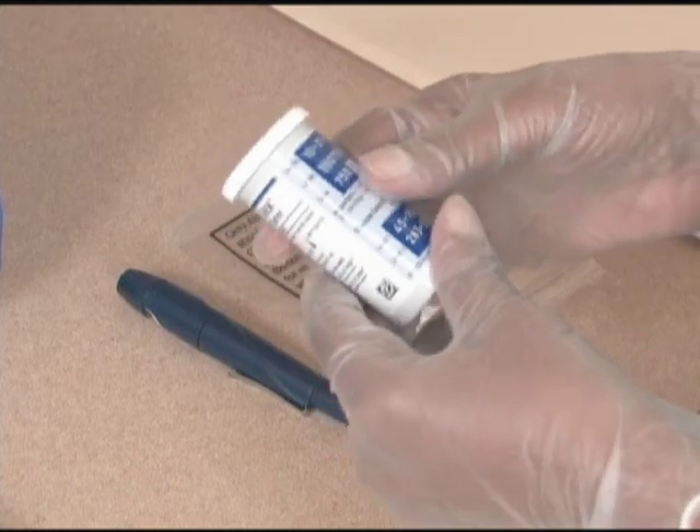Wash your hands and put on disposable gloves. Check the expiration date on the test strip bottle. Use a different bottle if the expiration date has passed.